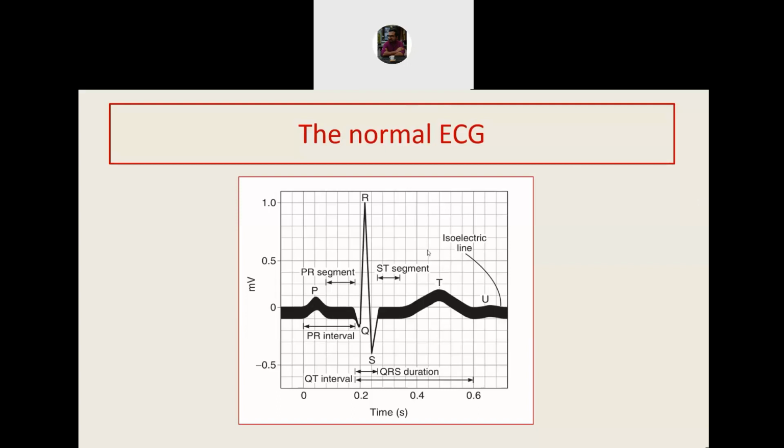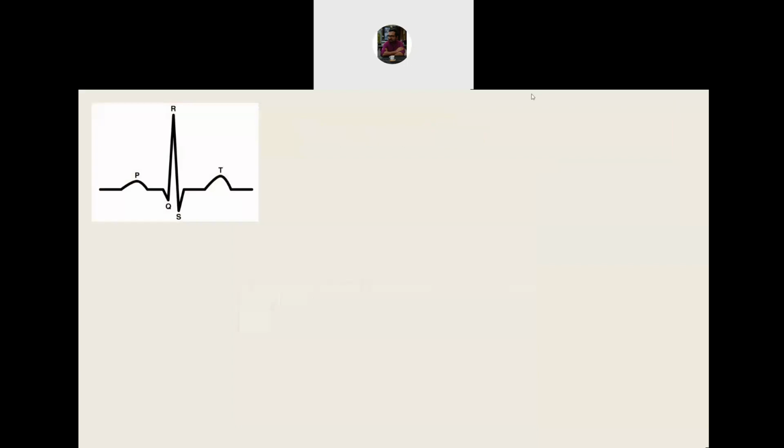So what are the different parts of the ECG, and what are their properties? We will go one by one through the different parts of the ECG. The waves of the ECG are named PQRST. That is also by convention, because when Sir William Einthoven published his work, he simply used a geometrical nomenclature system. So this could have been ABCDE.